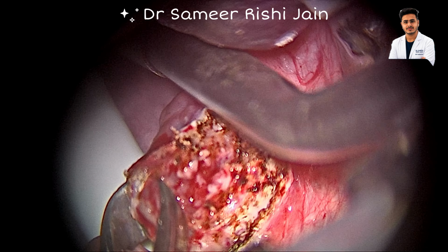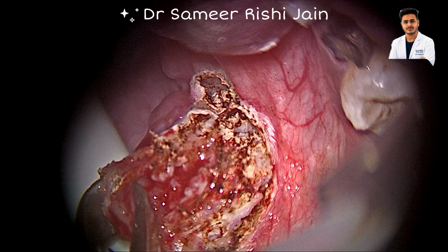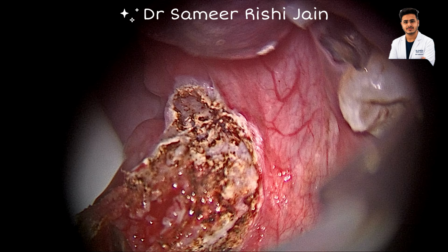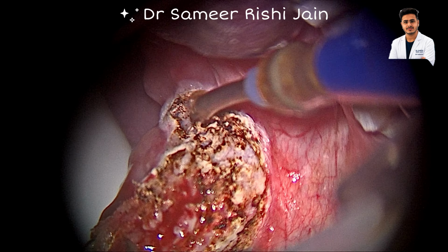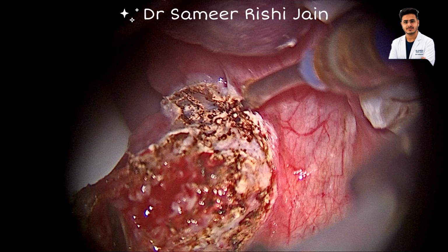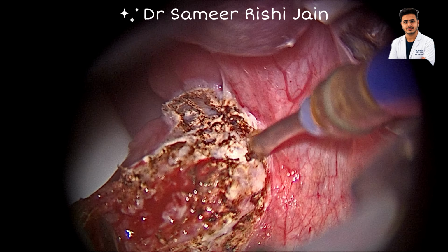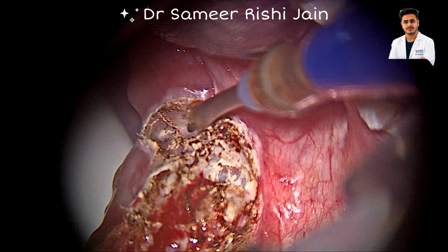Now I have changed my instrument from toothed forceps to an Ellis forceps so that I can give good counter traction and traction. I am able to see my plane in the lower part of the tonsil. Therefore, I extended my incision in the lower part, and now I am following up the plane towards the upper pole of the tonsil.